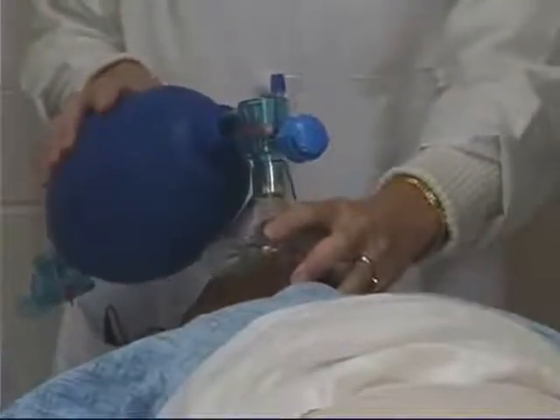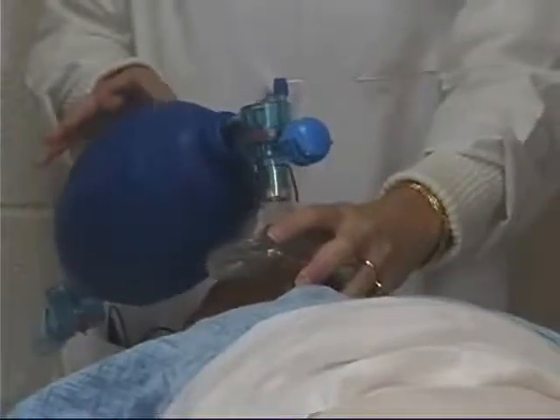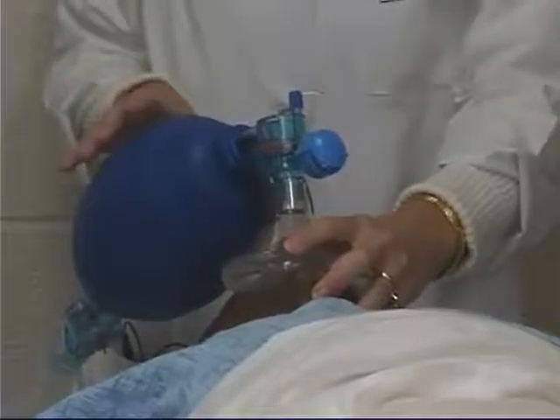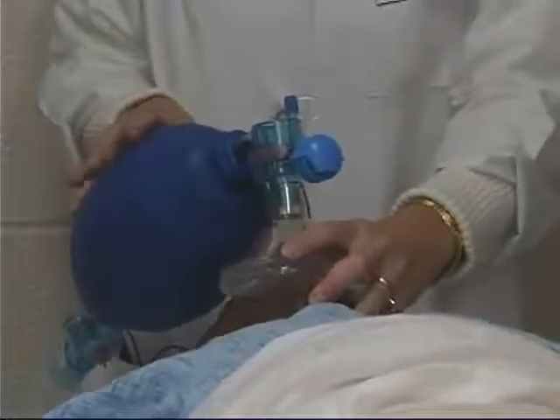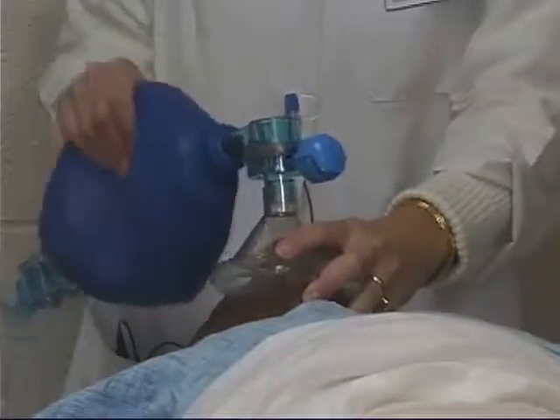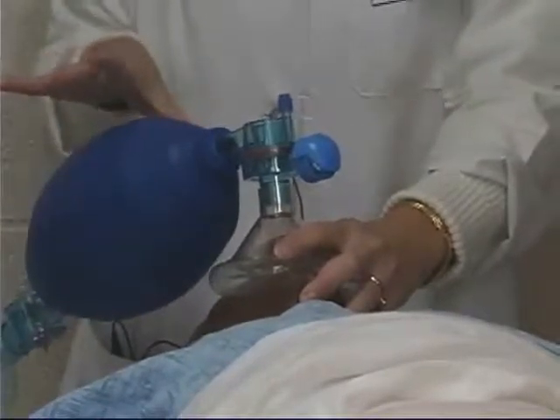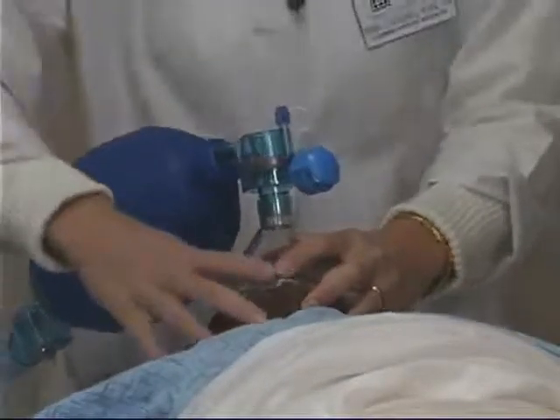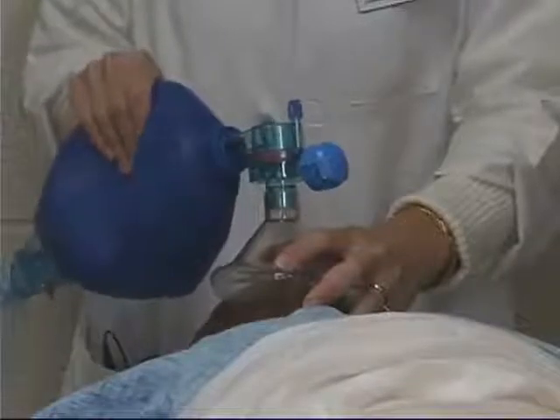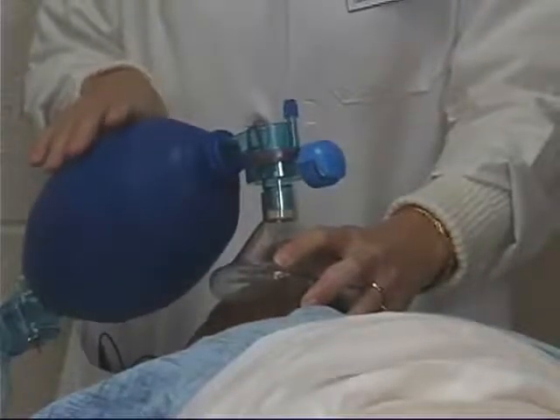You want to deliver one breath every 5 seconds for a rate of 12 per minute. And if the patient's breathing, you want to do this with the patient's own respirations. If the patient is not breathing, then you would do just one breath every 5 seconds. You'll squeeze this bag and release to deliver oxygen to the patient, keeping a tight seal on the patient's face. And that concludes our demonstration of bag valve mask.